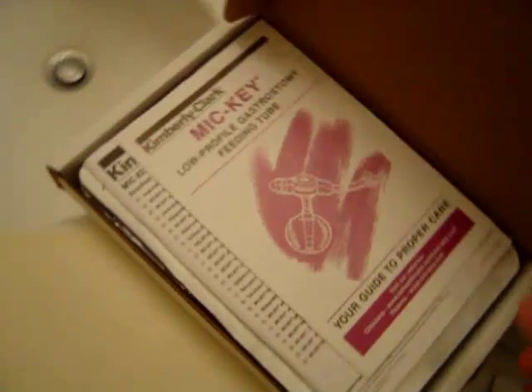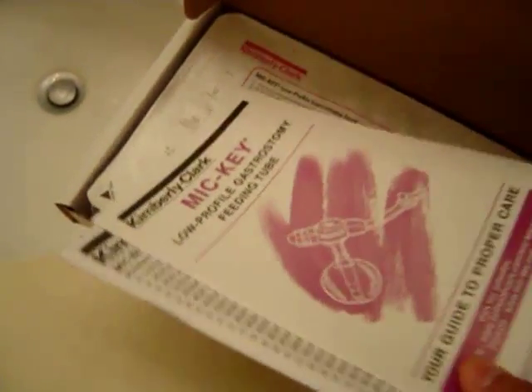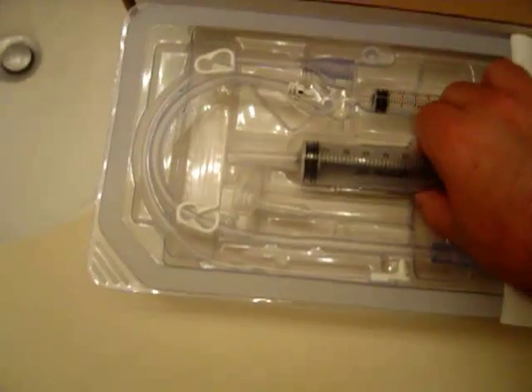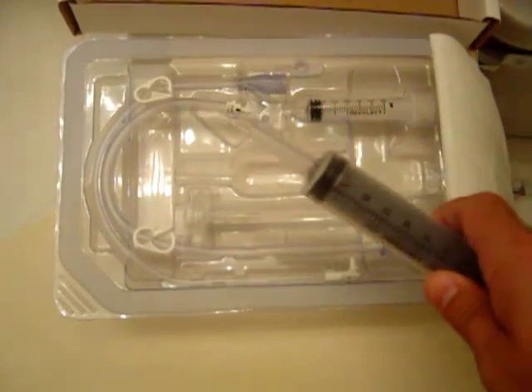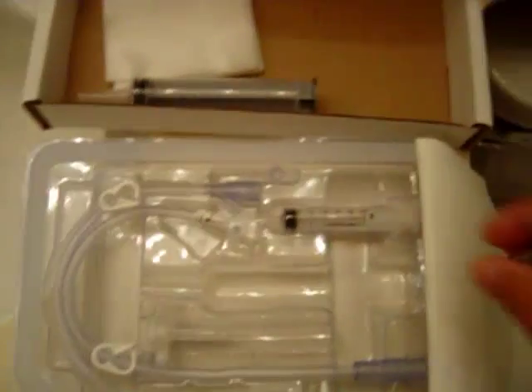Here's what it looks like when you open it — there are directions and package contents. I've already opened this so I'm just going to pull out the tray. It comes with its own 4x4, a 35ml cap-tip syringe that we'll use for any fluid you're going to feed through it.